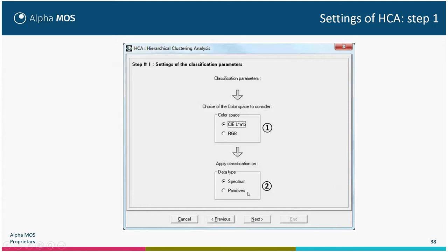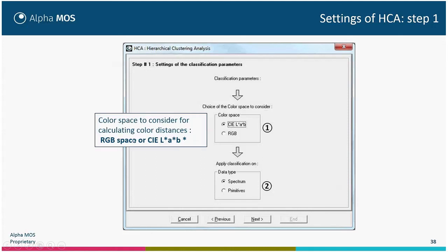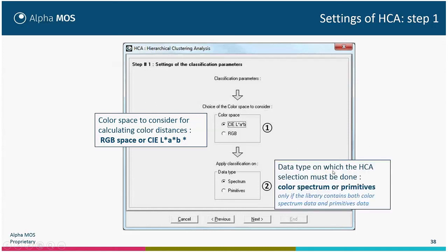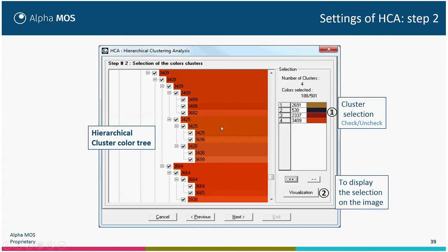Then you can have this spectrum classification. The color space will consider the calculated distance between the different colors of a single image. The data analysis on which the HCA must be done can be color spectrum or primitives. In the wizard, you will have the hierarchical clustering analysis. You select the colors — starting with the main colors to see if you can separate the main colors in a product. You may need to select a small number of colors. By clicking Visualize, you can see which color cluster gives which result.